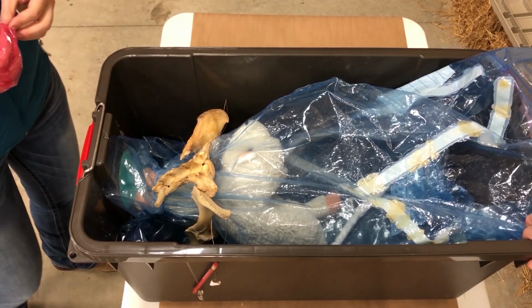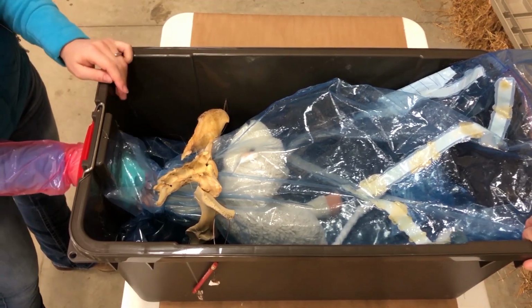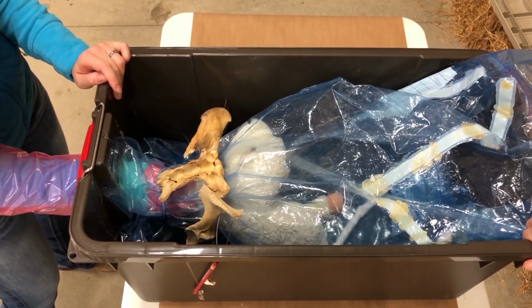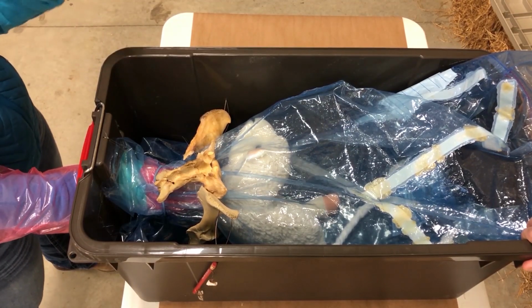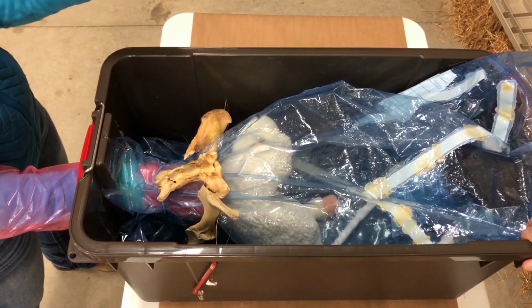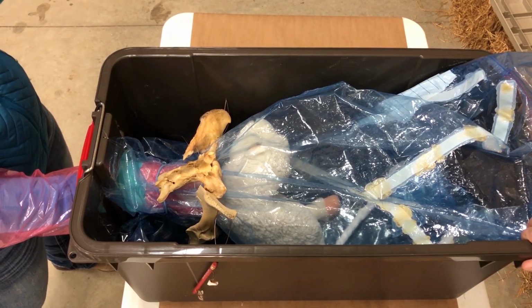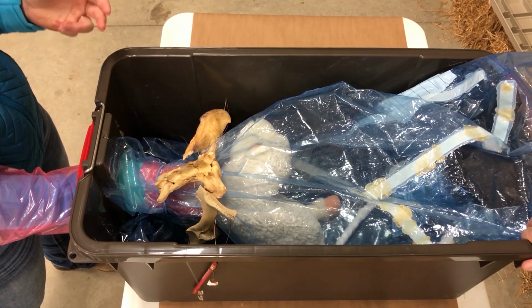When we're talking about having an animal with its head back and only the legs positioned, what you'll feel is just 2 front legs. Front legs, when we compare them to back legs, bend backwards, and back legs bend forward. So as long as you know the position of the head, you're doing okay in that stance.